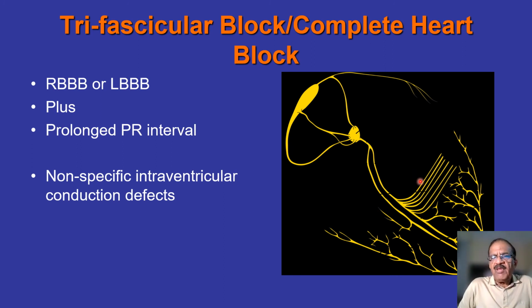Then finally, I think there is non-specific intraventricular conduction blocks. I do not have any slide for that, but I'll just describe it. Sometimes you see that the complexes are broader than normal, but they do not fall in any definite pattern. So we call it non-specific intraventricular conduction defects.